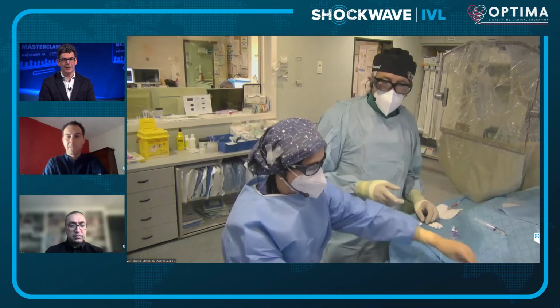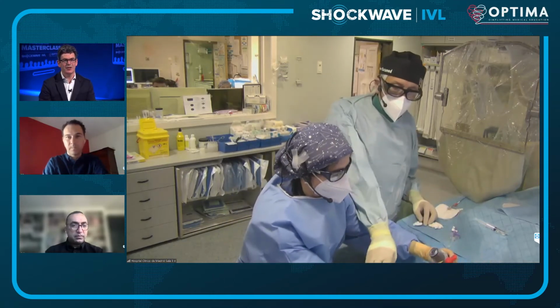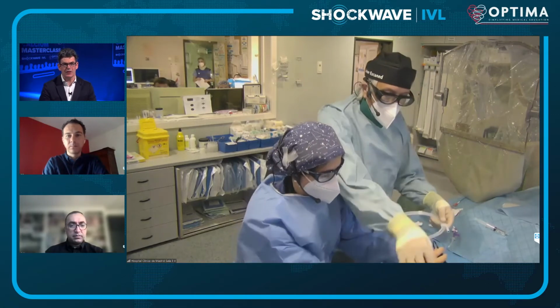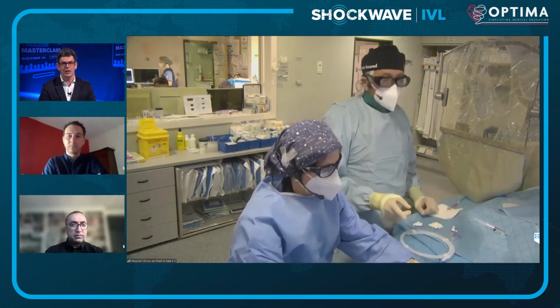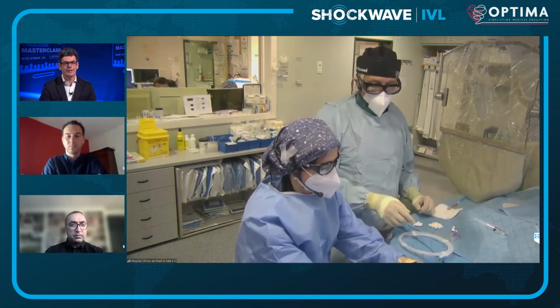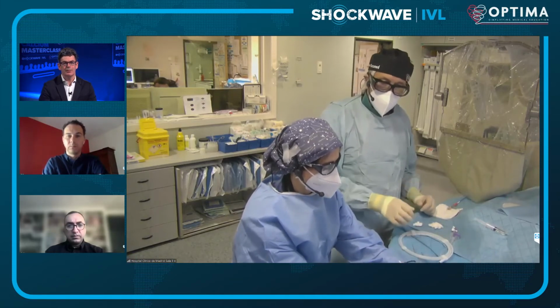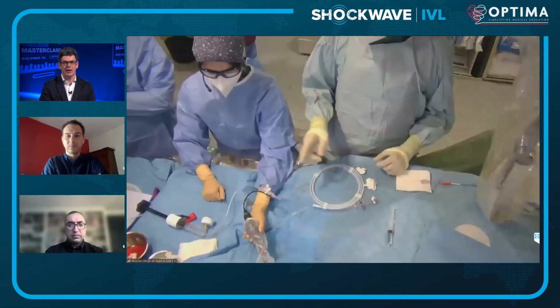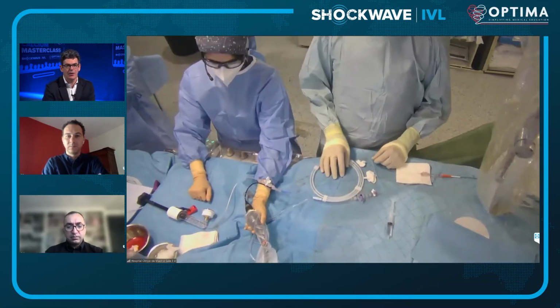So if it is okay with you, we would like to now please show you. Go ahead. So you've selected a 4mm balloon. That is the largest size balloon for the coronary circulation. So Nieves is, absolutely. And perhaps we can see you doing the setup on the table. Is it possible to angle your... Yes, we can see it very well.